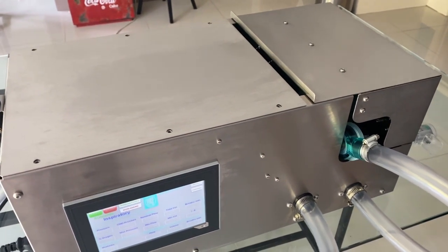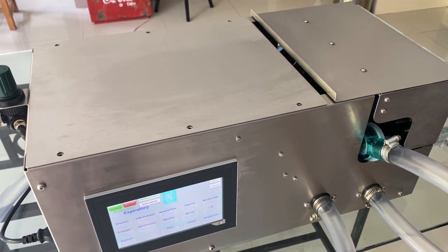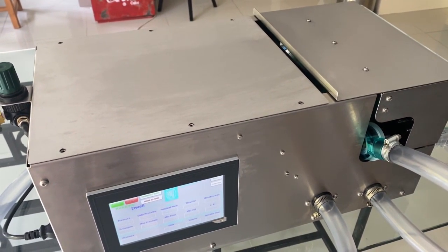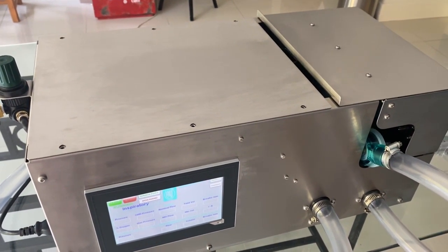Many thousands of companies took part in this call by the MHRA for ventilator design and although we were not chosen for the final product, our concept did make it to the last few that were reviewed by the UK Government Cabinet Office.